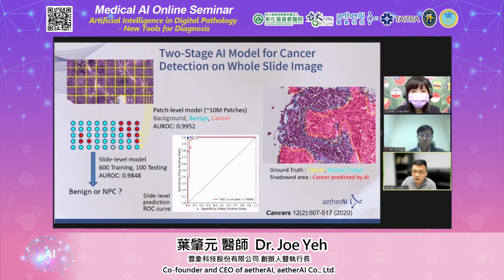On the right-hand side, you can see how AI is helping doctors to perform diagnosis by drawing an overlay of red color over the cancerous area.